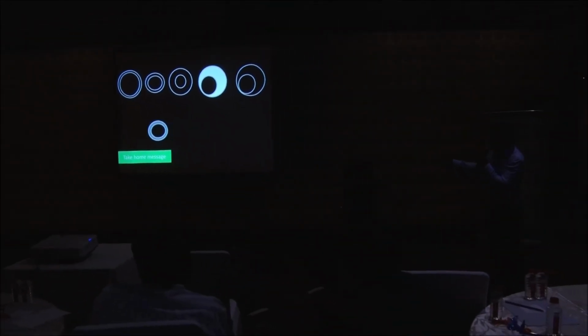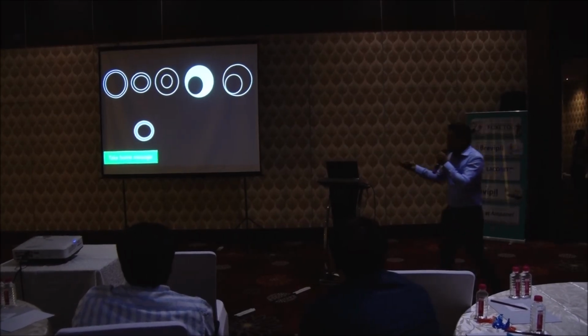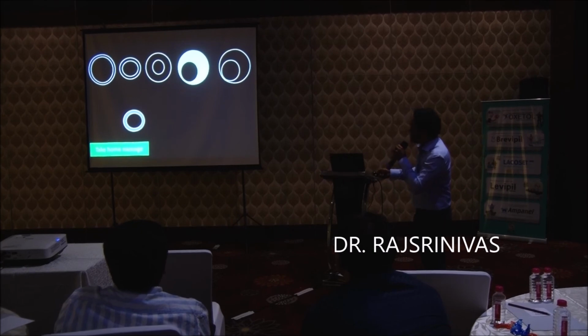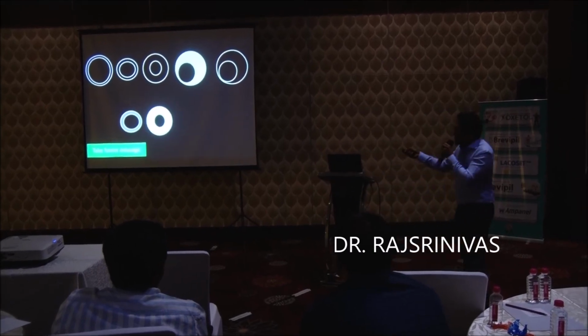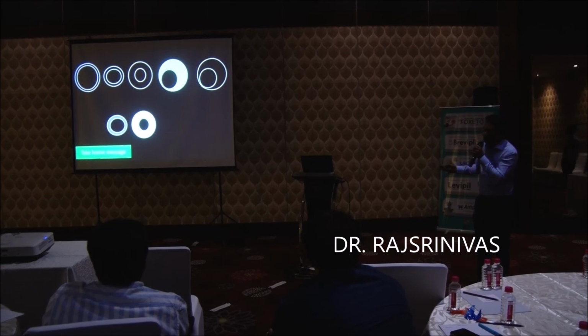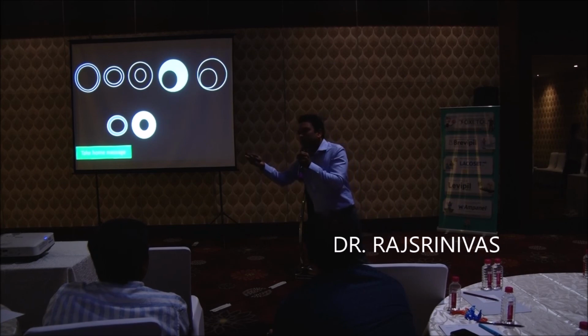So the first condition, what do you think it is? There is negative remodeling. I want answers from the audience here. There is negative remodeling. There is maybe some enhancement in the wall of the artery. Diagnosis? Fantastic, Moyamoya disease. The lumen is reduced, the wall is thickened, there is grade 2 enhancement, very avid enhancement, concentric pattern. Diagnosis?